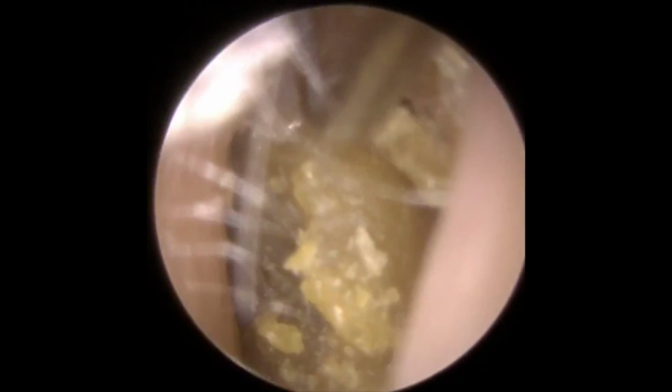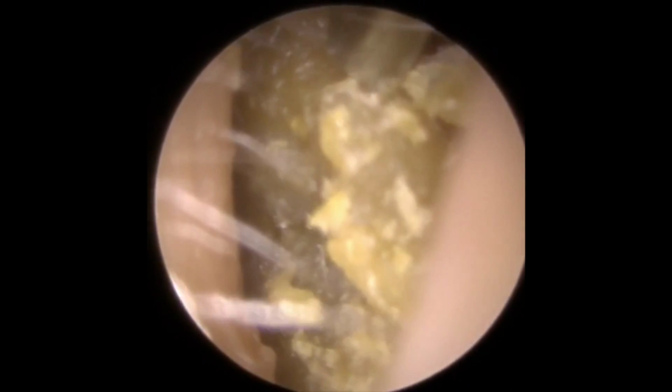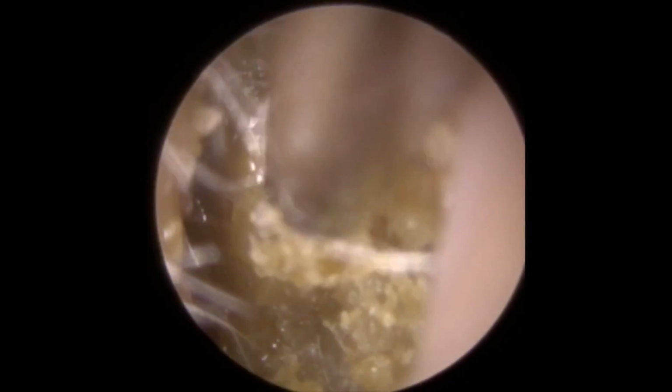So we're just spinning this wax a little bit, just guiding it around. Now I'm working on that section there, the smoother section, because sometimes you get slightly softer bits of wax when you turn it, so the front end might be really brittle, but you might get softer pieces behind. Unfortunately, in this case, it was just brittle all the way around, and there was hardly any movement to this, so it was a real painstaking procedure to take this away.